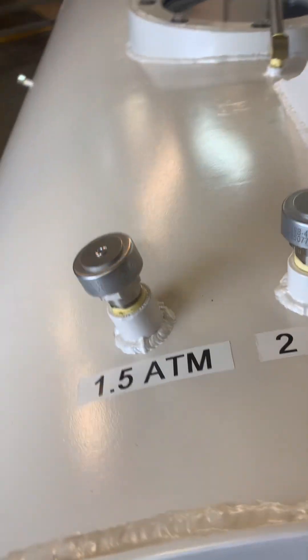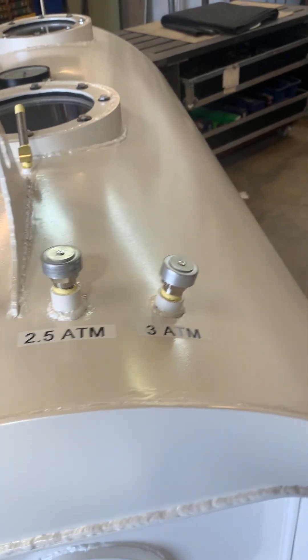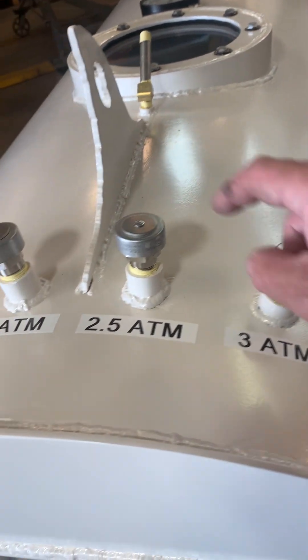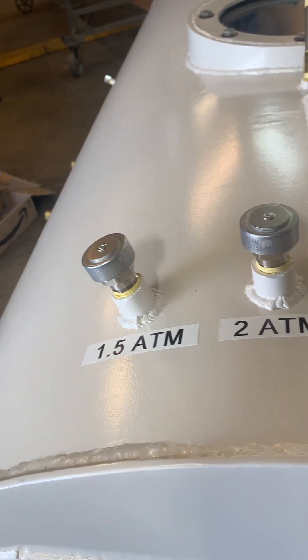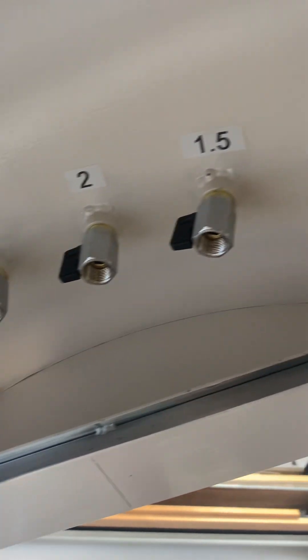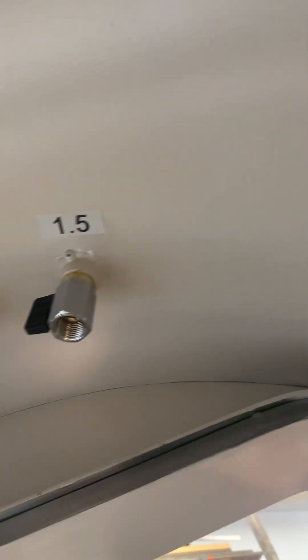Up here you can see we have four different pressure settings. I did this one differently — I put these on the top of the tank directly through, and then on the inside of the tank you can actually decide which pressure you want from the inside so you can control it better.